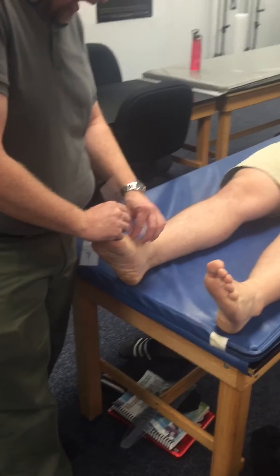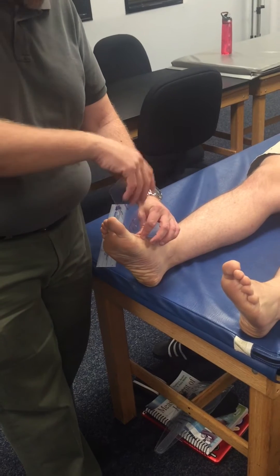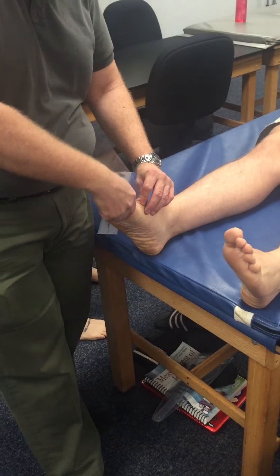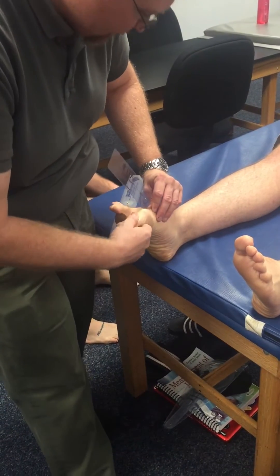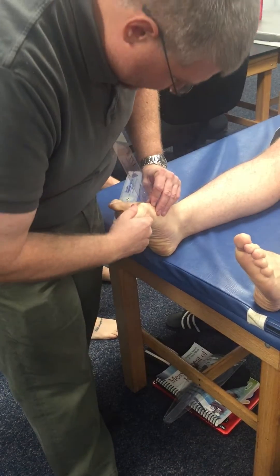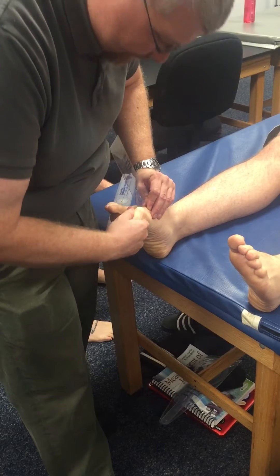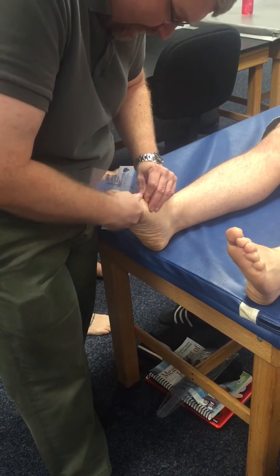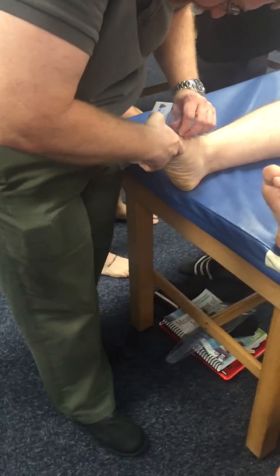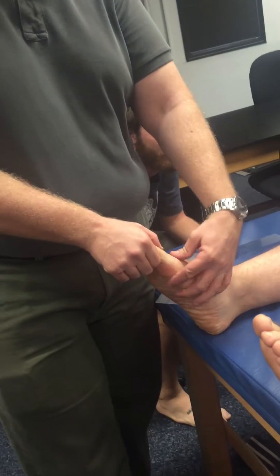At the MTP joint, the proximal arm of the goniometer is parallel with the first metatarsal and the distal arm is aligned with the proximal phalanx. For flexion measurement, I'll ask him to push down. I do it passively first to get a number in my head, then set the goniometer to it. Zero is that straight line going up the leg.